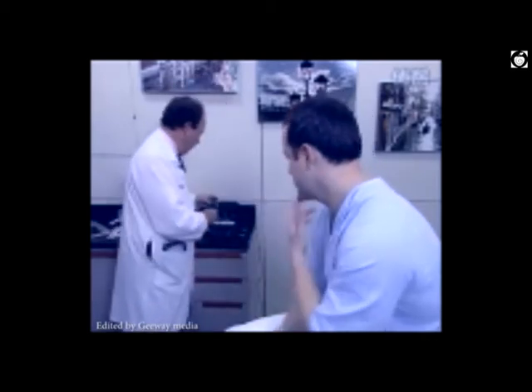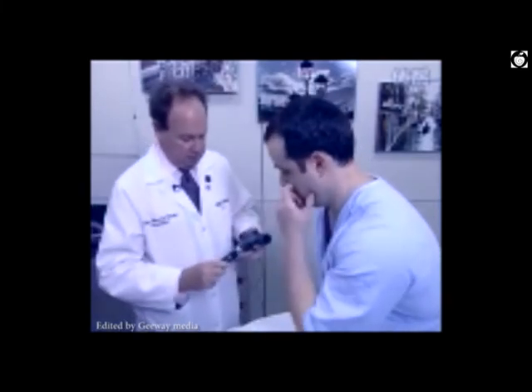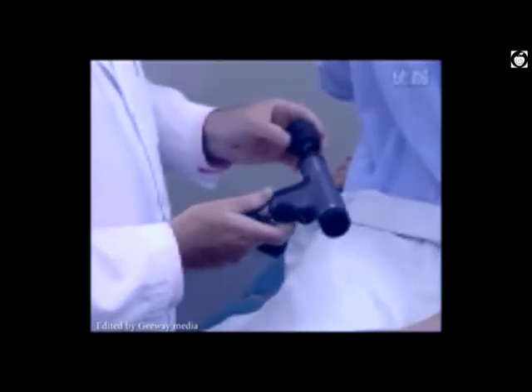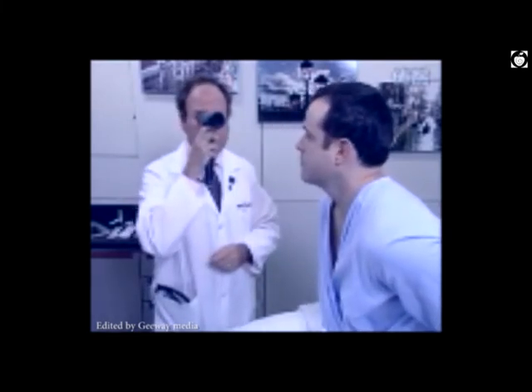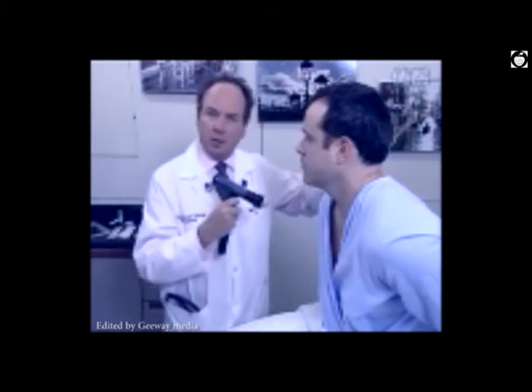The other advantage to the panoptic is that there is a greater working distance between the patient and the examiner, and I'd like to demonstrate it right now. The panoptic ophthalmoscope works with any of the standard 3.5 volt handles. This is the head, and this is the eye cup, and I will demonstrate its use in just a moment. First, one wants to use the continuous focusing wheel to focus on a distant subject, to get that subject in sharp focus. And then the equipment is used basically the same as your standard direct ophthalmoscope.